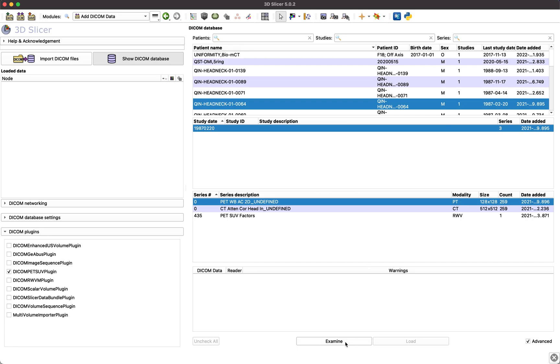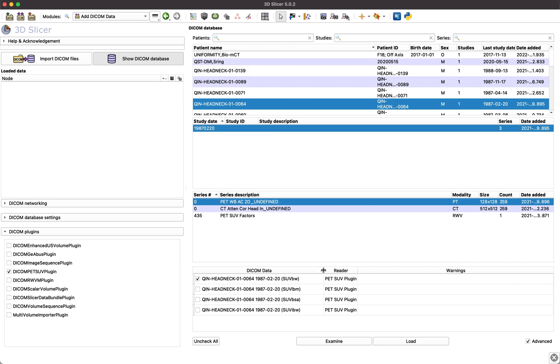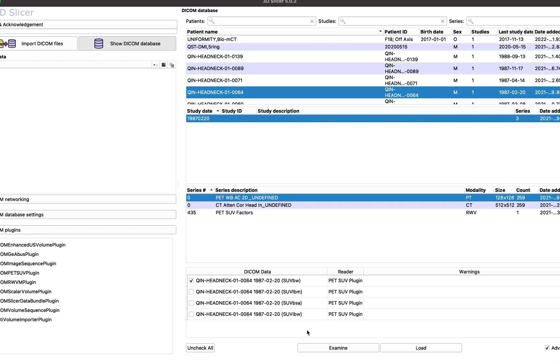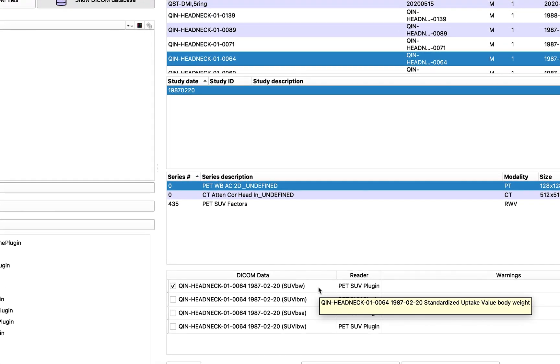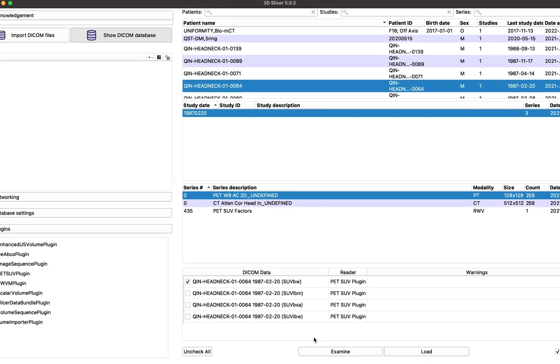Then click Examine to analyze import options. The PET SUV plugin is a part of the PET DICOM extension and will offer the option to load the PET scan as an SUV normalized data set. By default, the data set will be loaded as an SUV body weight normalized data set. In addition, the tool also supports other SUV normalization variants like SUV lean body mass, for example.